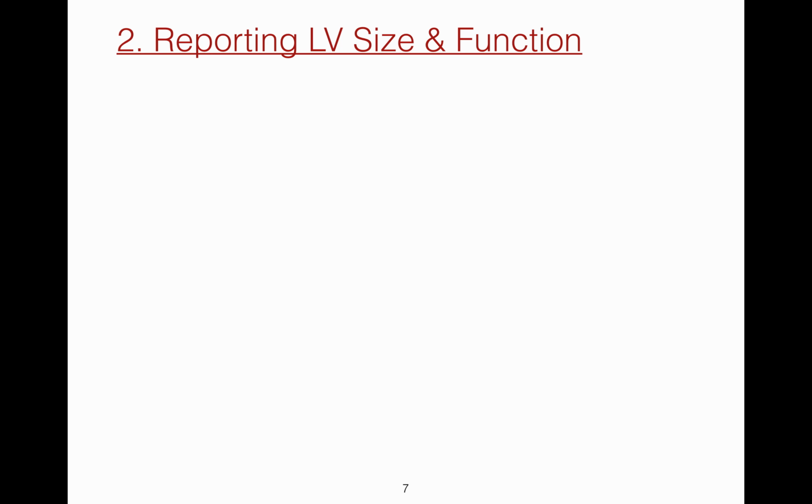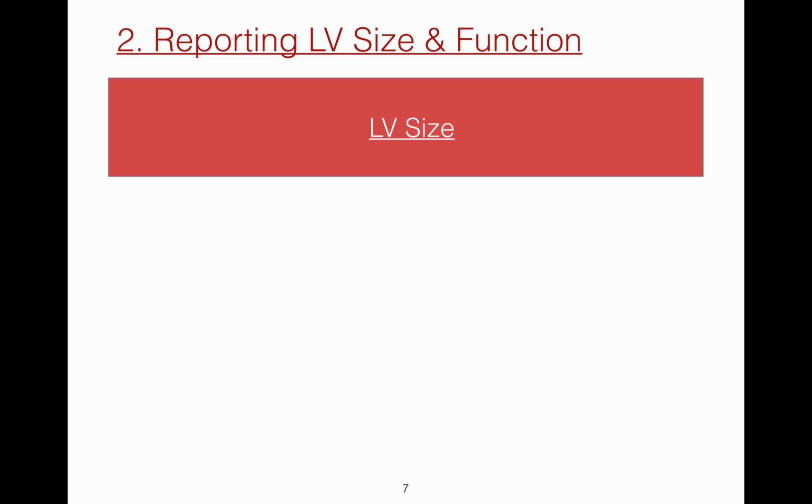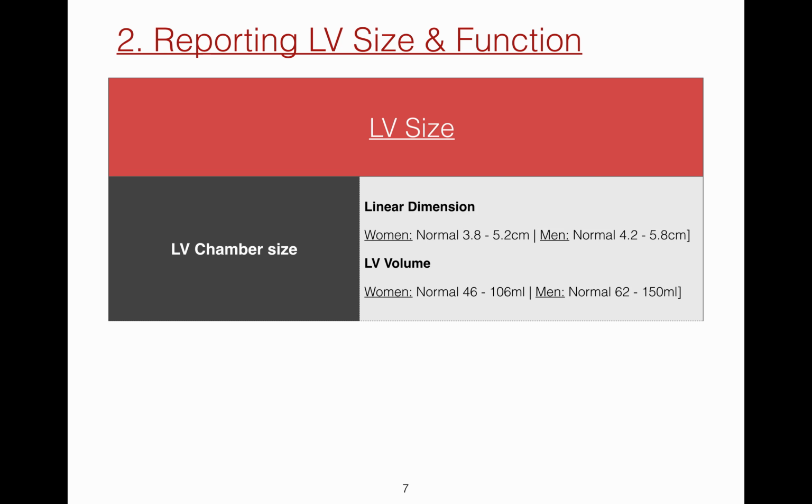In this initial reporting lecture, I'll primarily discuss reporting left-sided structures and function. A more comprehensive reporting lecture will be given next year. LV size. The chamber size and wall thickness are two important measurements and should be part of all routine exam reports.